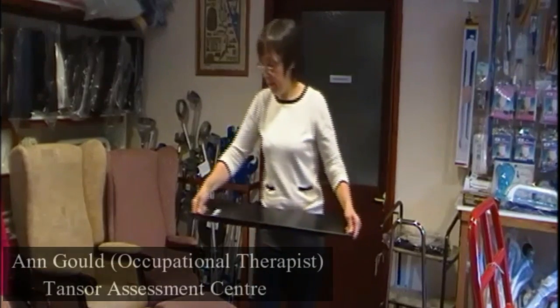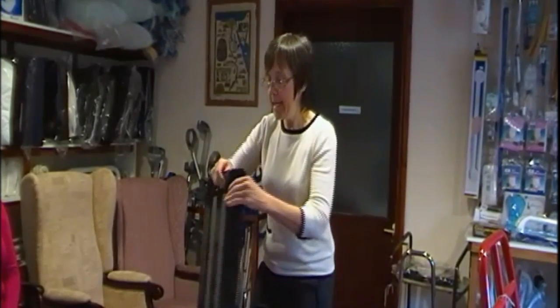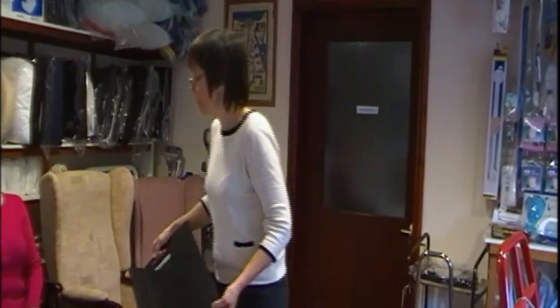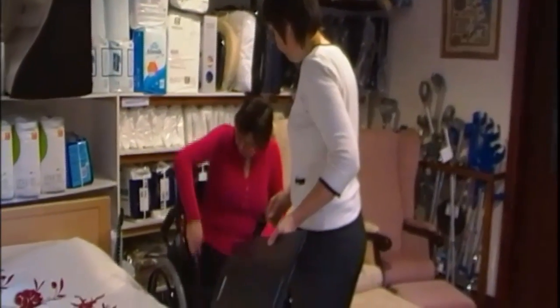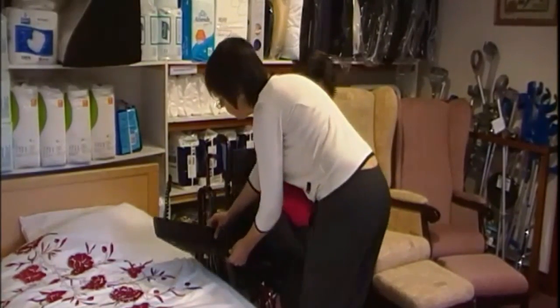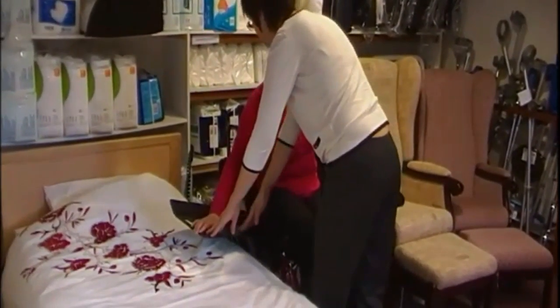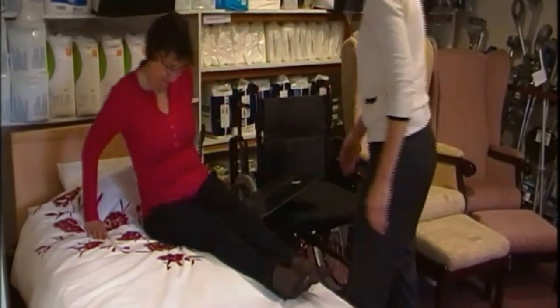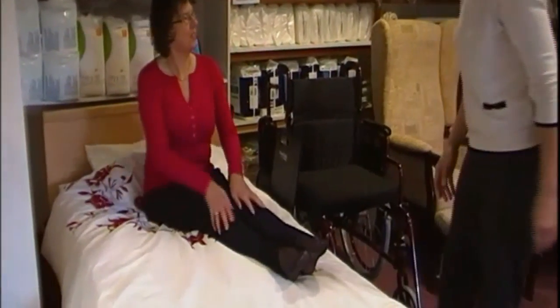Right, this is the Easy Glide, which is one of the Romedic products. It's a transfer board with an added flexible surface which enables it to fit over the wheel on your wheelchair. So if we just demonstrate this, now Christine, if you put the arm up on your wheelchair, if you lean slightly that way, and we'll put this underneath you, if you notice the flexible bit will go by the wheel. Right, now if you slide yourself down, it assists you to get onto the bed, and we can easily remove that and leave it ready for your next transfer. Perfect.